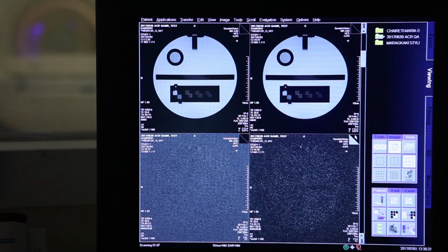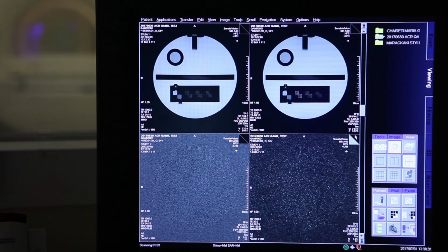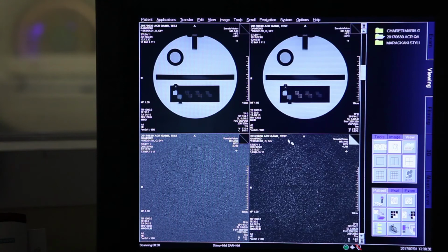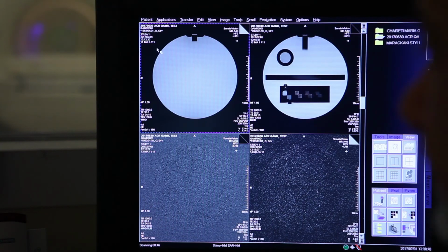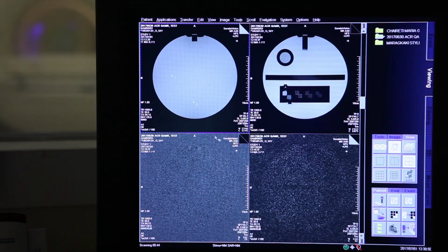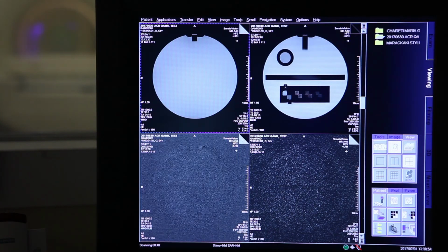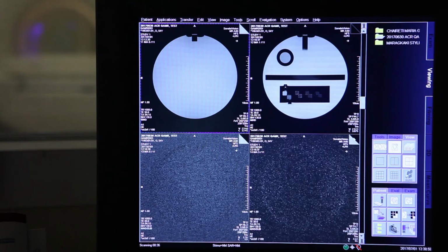Now let's go. I'm going to see exactly what I mean. So you go to the slice number. Let me check. I have to have the same slices. And I'm going to take the PDs. This is the difference, and this is the PDs. You check the slice number in the middle. This is number 6. Here it is. Study 1, and you have image 6 from 11. Now we put the same position here. Measure here. There it is.